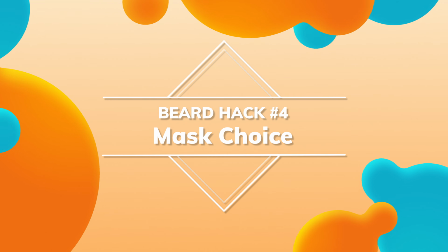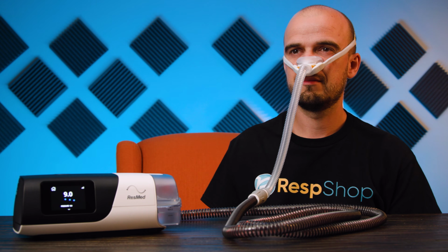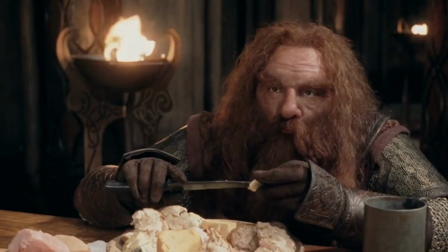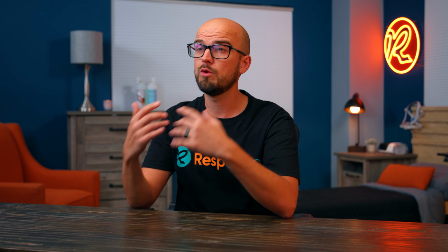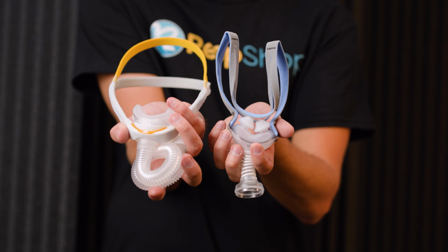Hack 4. Choose a mask that avoids your facial hair areas as much as possible. If it doesn't need to seal against your facial hair, then your facial hair makes no difference at all. So bear that in mind when shopping for masks. If you really are at the most extreme Sasquatch end of the beard game, then consider masks that have small nasal-style cushions and straps that don't go below your ears to avoid the facial hair area, like ResMed's P10 or the Fisher & Paykel Solo.